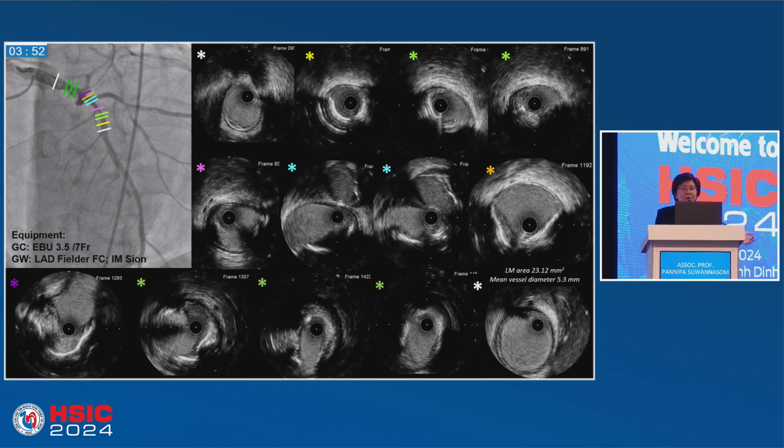As you can see, there's a lot of color here, but we have just a short calcified lesion here, and this is the opening of the intermediate, which has quite an unusual angle, so it's quite tortuous. And as you can see, the ulcer that you see from the angiogram also contains attenuated plaque. So as you can see, everything is in darkness. So it's not calcium, it's just attenuated plaque.